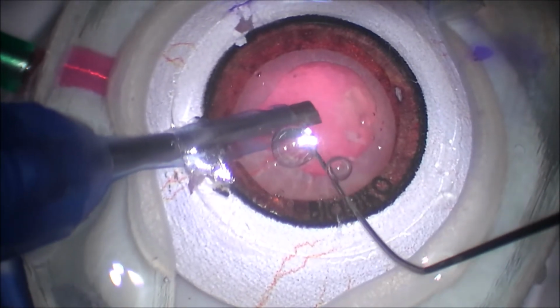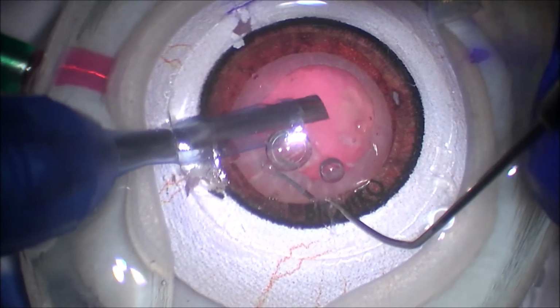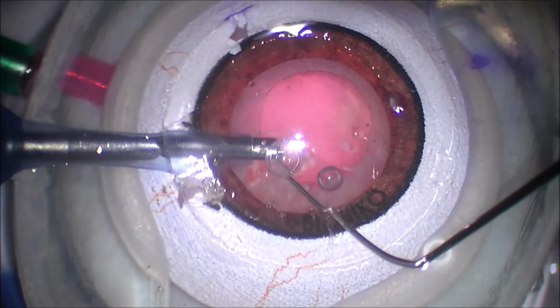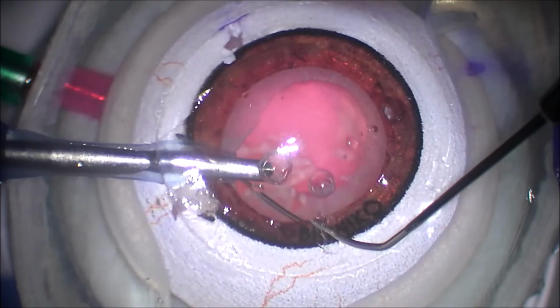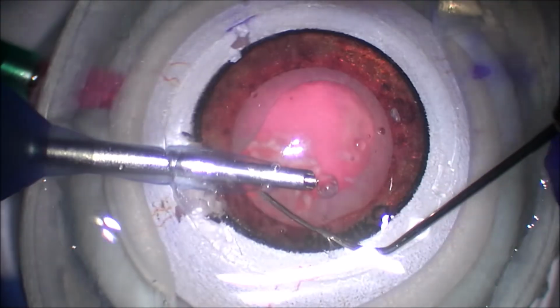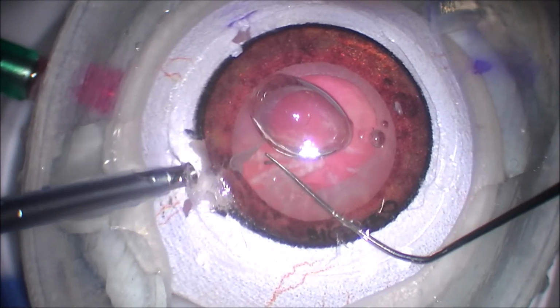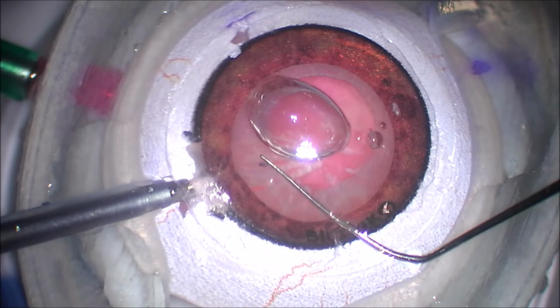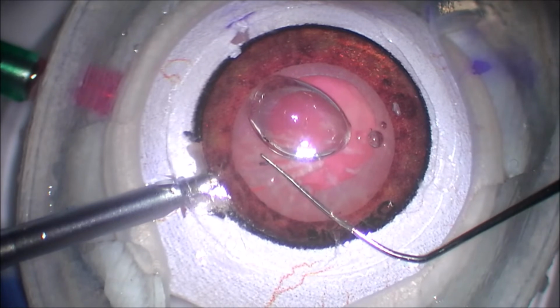And what's nice about this is you can use this on any phaco machine. What we used here was the AMO Compact, and you have to hang the BSS bottles with that machine. And so I just cut a small hole in the top of the bag, and we just kept filling it up with water instead of having to use our precious and quite costly BSS. And so we were just using tap water and pushing it and refilling the bag each time. Here she ran out of some water, so we're having to change out the bag. And again, really, this is a fairly low-cost way of learning how to do cataract surgery on an artificial eye.